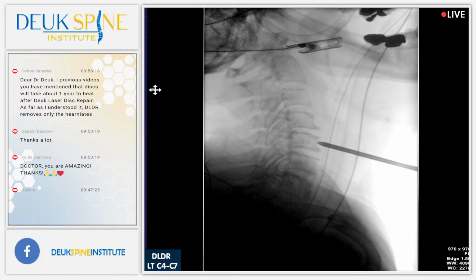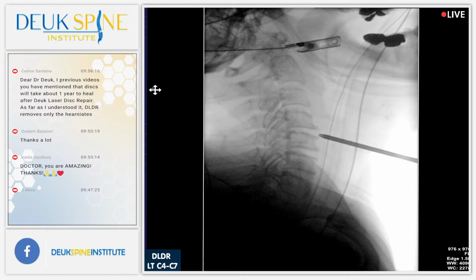You wear the lead gloves? I wear leaded gloves, yeah. You see the black on underneath my gloves? That's lead. All right, shot. We're on top of the disc at 4-5.